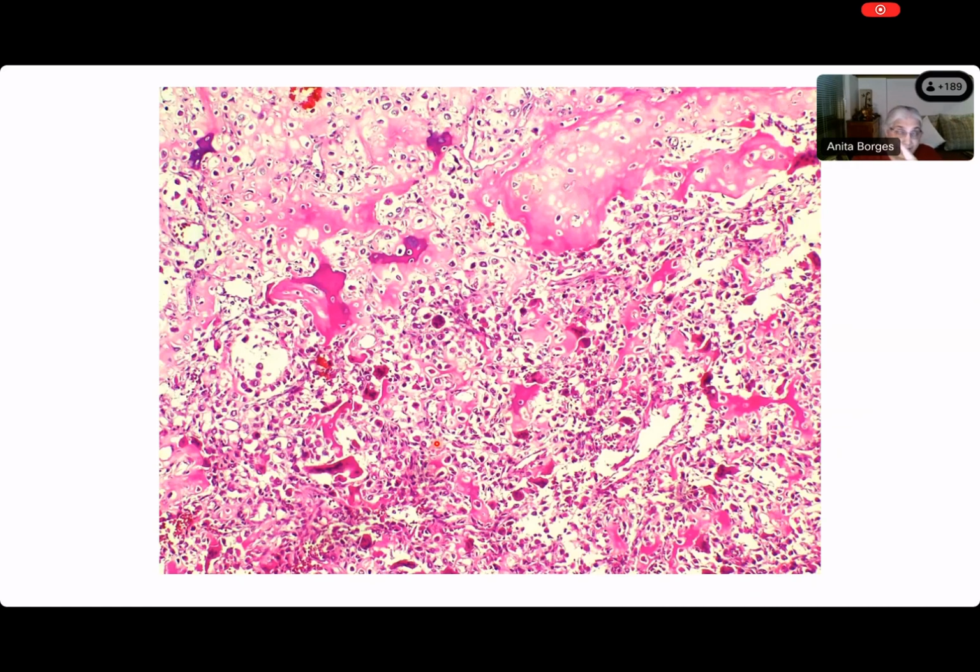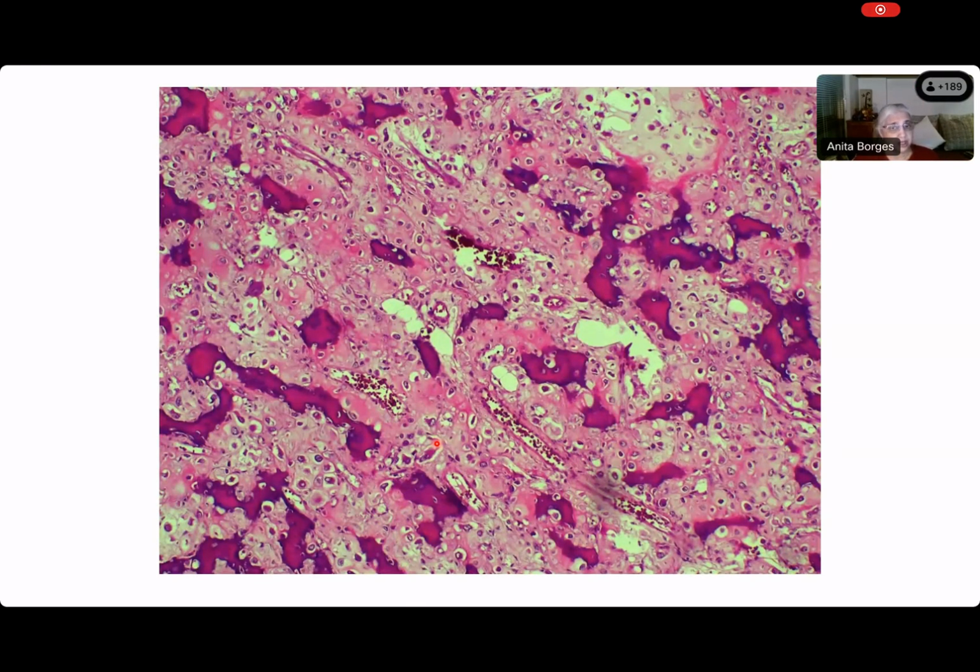So it has a chondroid look, but in this you are seeing a far more pink matrix. Not only that, what are you seeing here now? You must have seen all this before in your slides. Okay, you see that there are two colors here. There is a grayish area which you would accept more as being cartilage, and here you're seeing pink stuff which you would otherwise recognize as osteoid. This funny looking pink material looks like osteoid, and yet the cells sitting in this osteoid are chondrocytes. Yes, they do not have the appearance of osteocytes. They have the classical appearance of chondrocytes sitting in a vacuole.